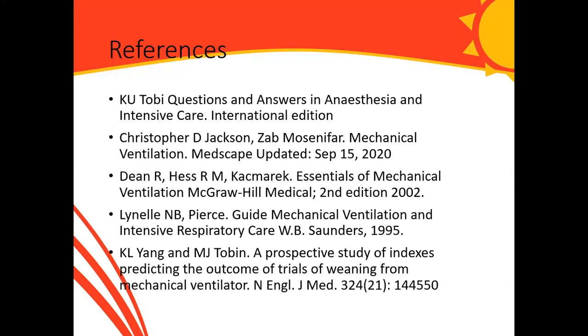I wasn't sure whether it is the frequency, the respiratory rate divided by the tidal volume. Yes, it's respiratory rate over tidal volume, less than 100, with tidal volume in liters.